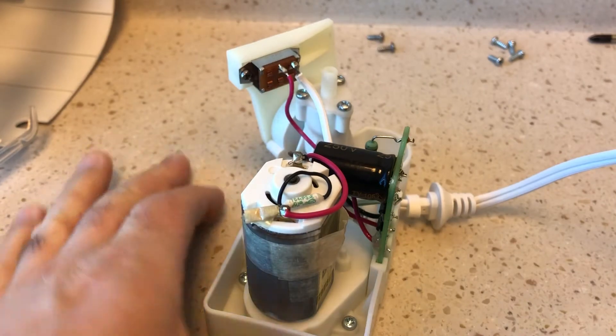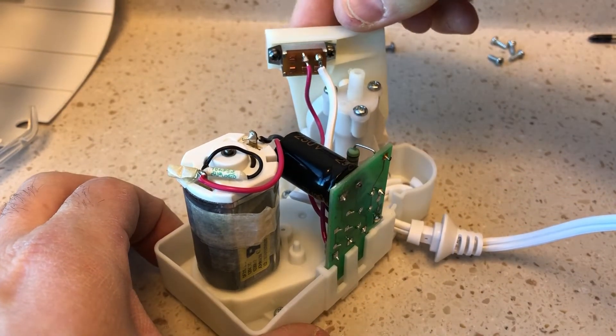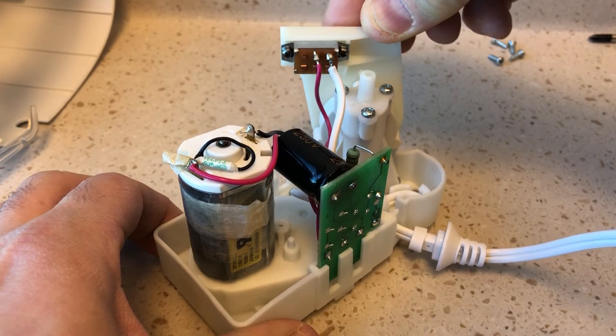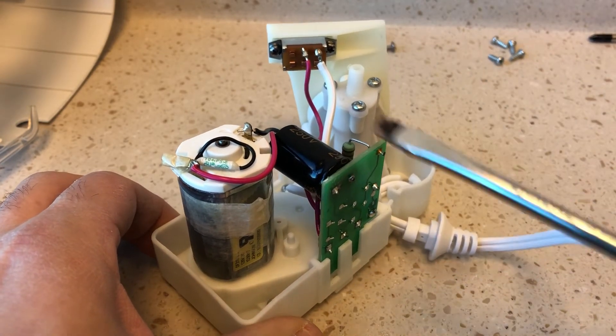Here we go — you can see it has no problem running. As soon as I remove this from that contact, be careful because this capacitor is still live.